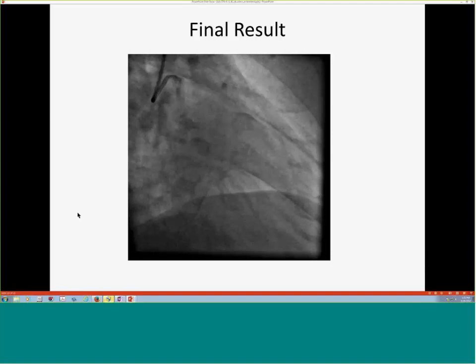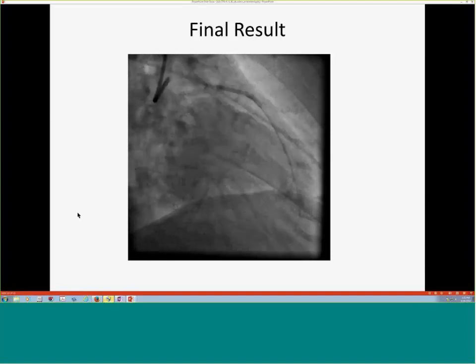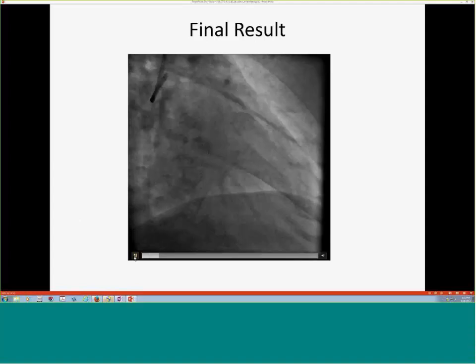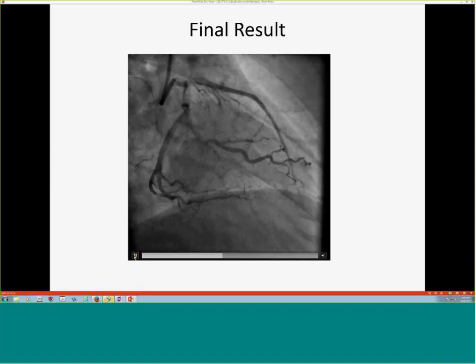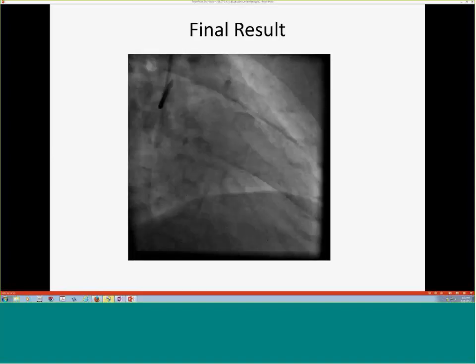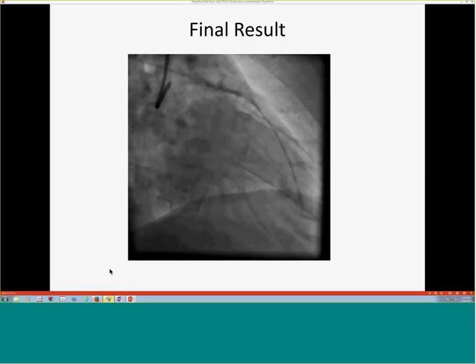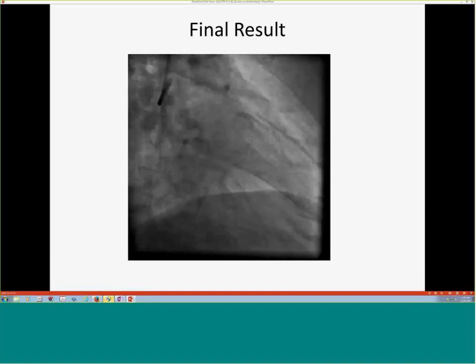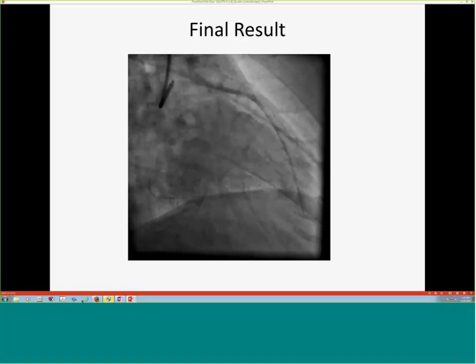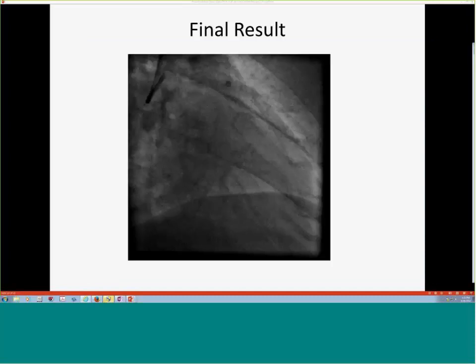Well, no, I think you're right that you cut off some diagonals, but you have some septal perforators, and I suspect that they'll plump up over time, and this may actually make the patient feel somewhat better. So I think you'll have to see over time what the diagonals look like, and you may end up thinking about doing something else with the diagonals at a later time. Yeah, that was going to be my next question.